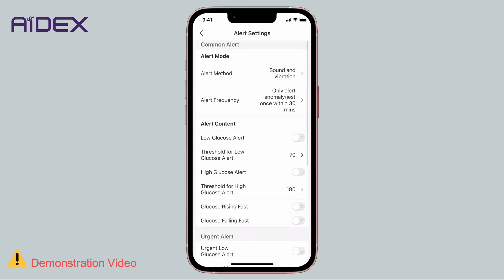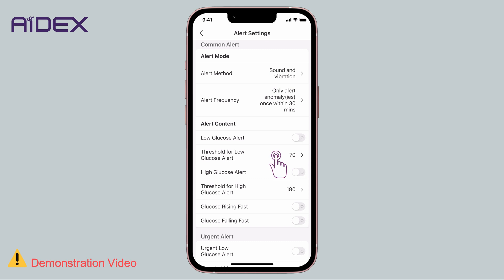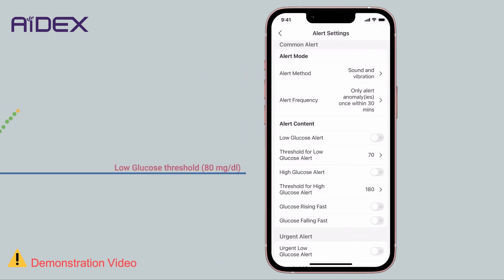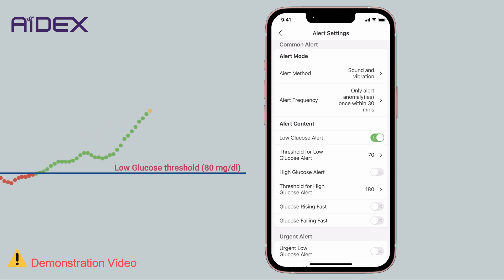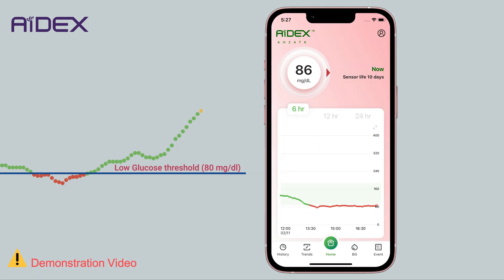For Common Alerts, there are four different types. First, Low Glucose Alert: you can enable or disable this alert and set the minimum allowable blood sugar level by moving the slider left or right. This value represents the lower threshold of the target range. If glucose readings fall below this value, the trend will turn red and the system will activate the low glucose alarm.